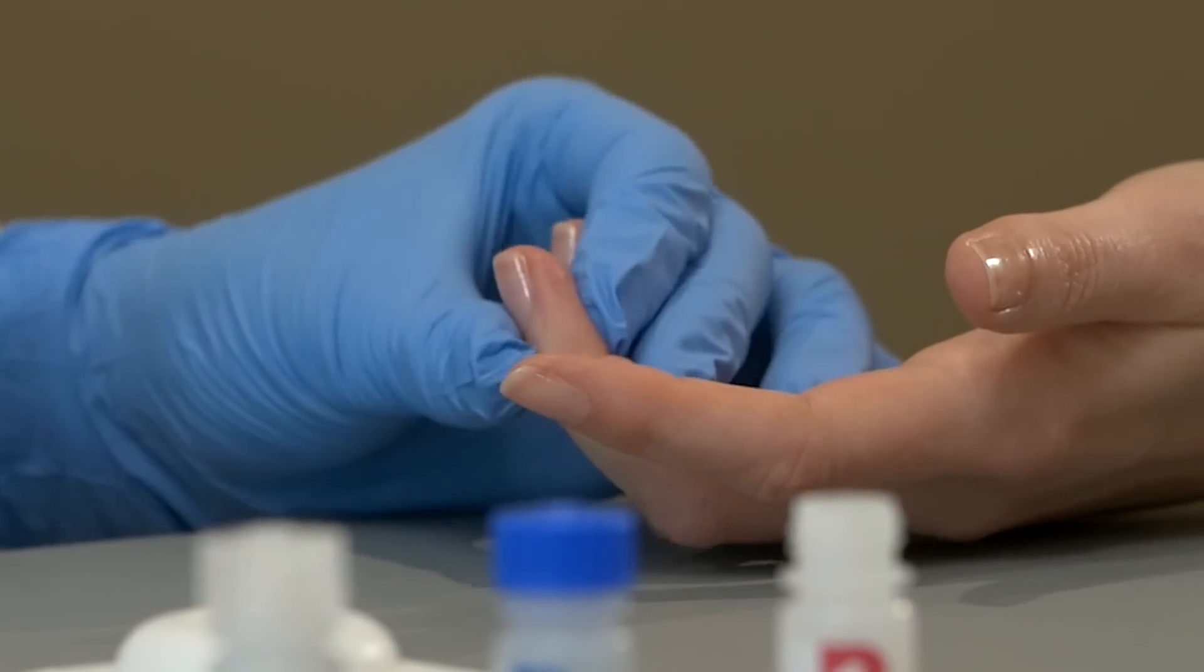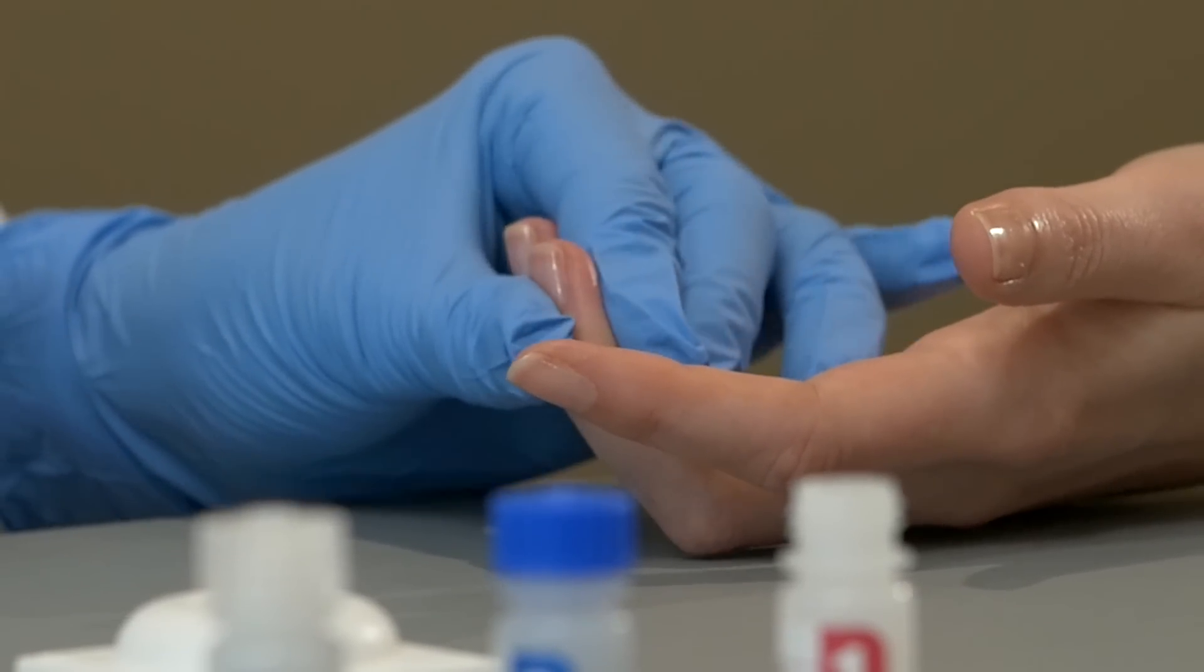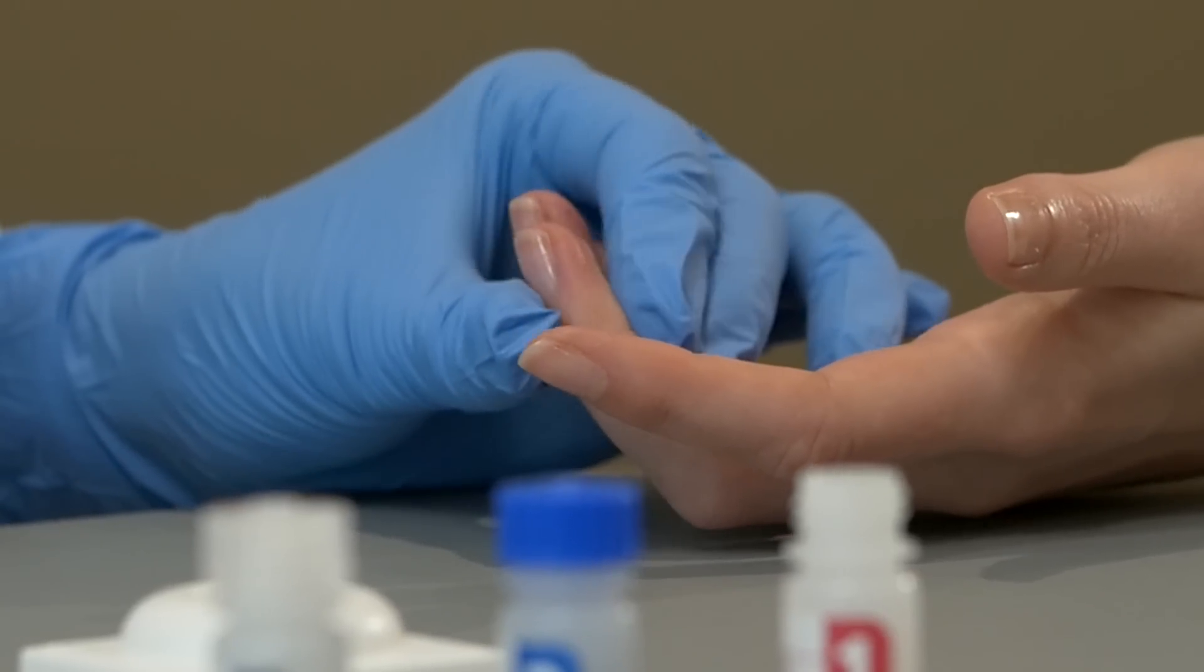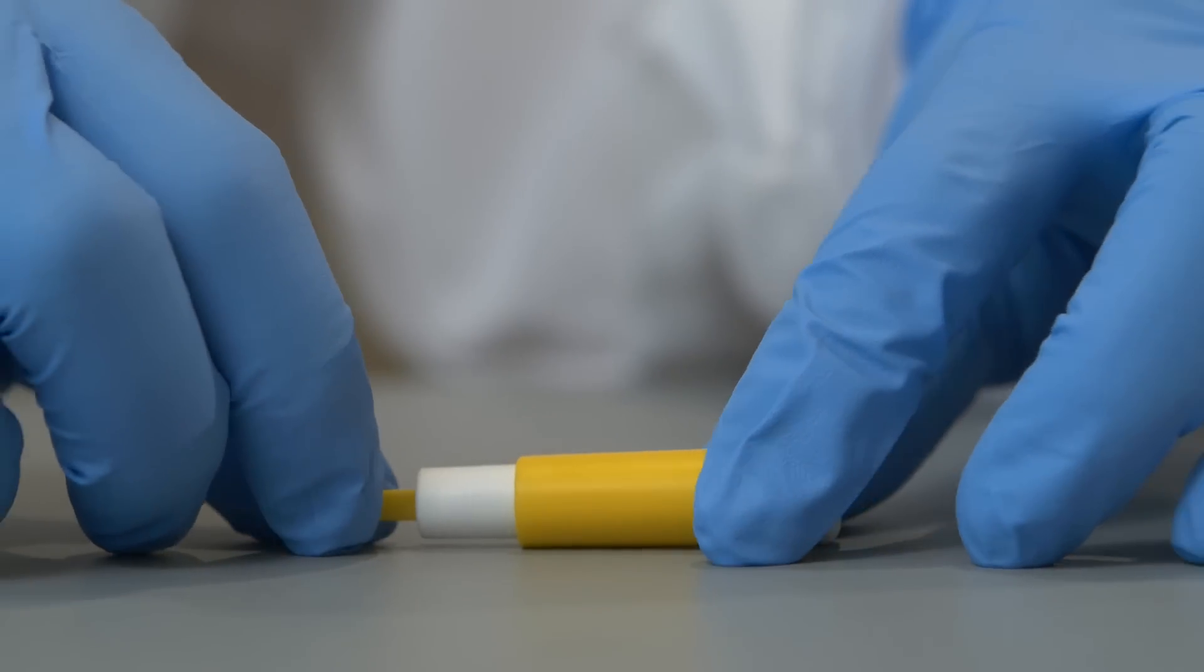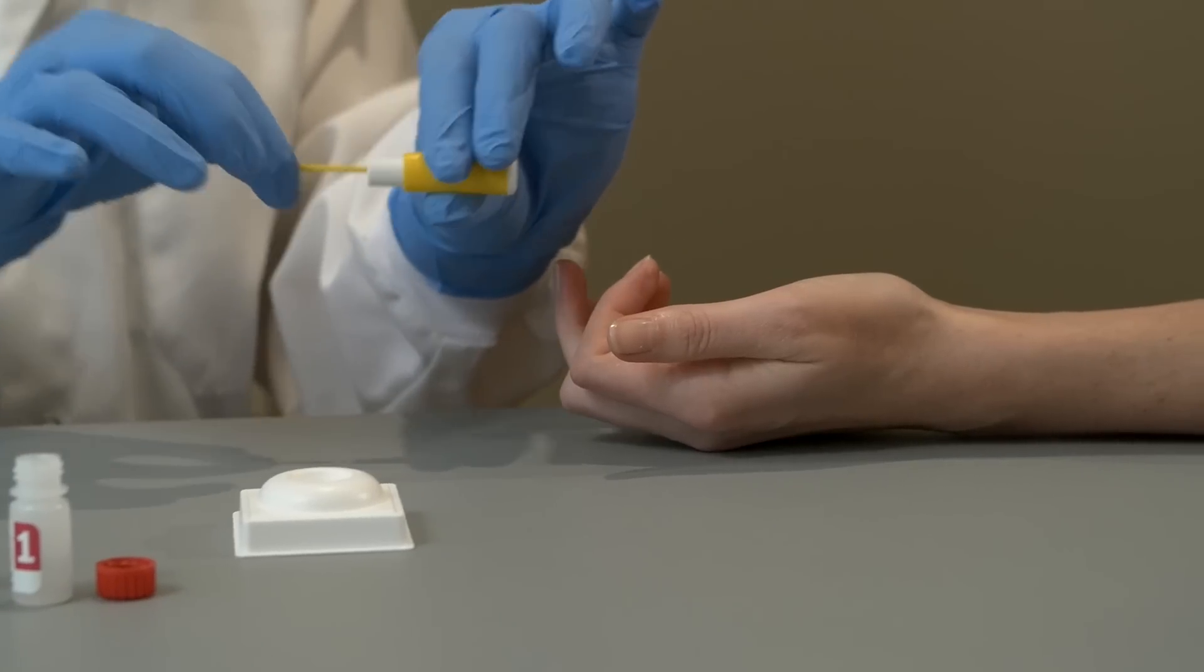Massage the patient's finger in one motion towards the tip to allow the blood to move to the surface. The fingertip will become slightly pink. As soon as the finger is dry, twist and remove the protective tab from the lancet.